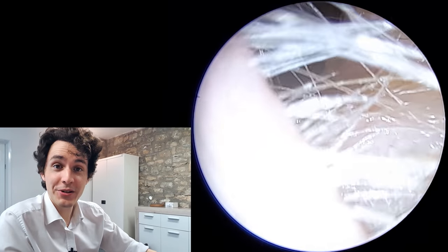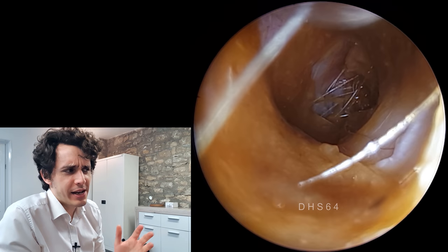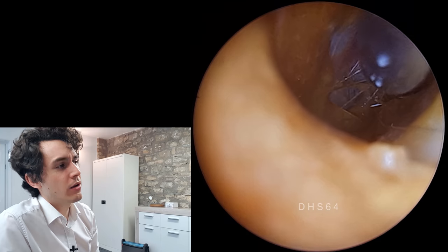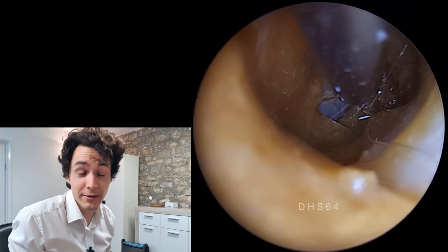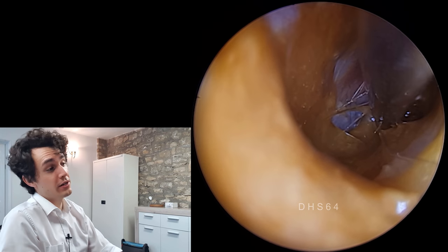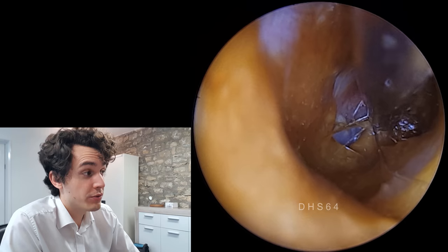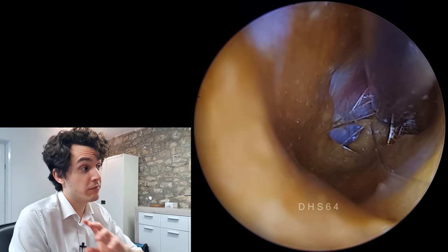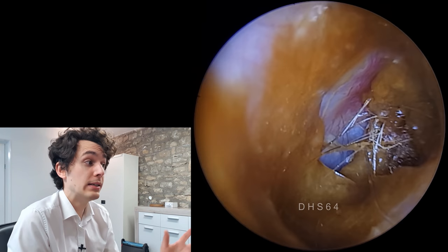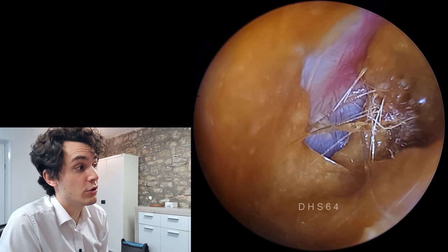Hi everyone, it's Conor here from Durham Hearing Specialists. Welcome to a different video today. Very rarely do we on any of these audiology or ear channels — like Dr. Zhao, myself, or Rhys O'Neill — talk about irrigation, which is basically flushing the ear out with liquid, in most cases water, although some people add things like hydrogen peroxide. But in this case I'm just going to use water.